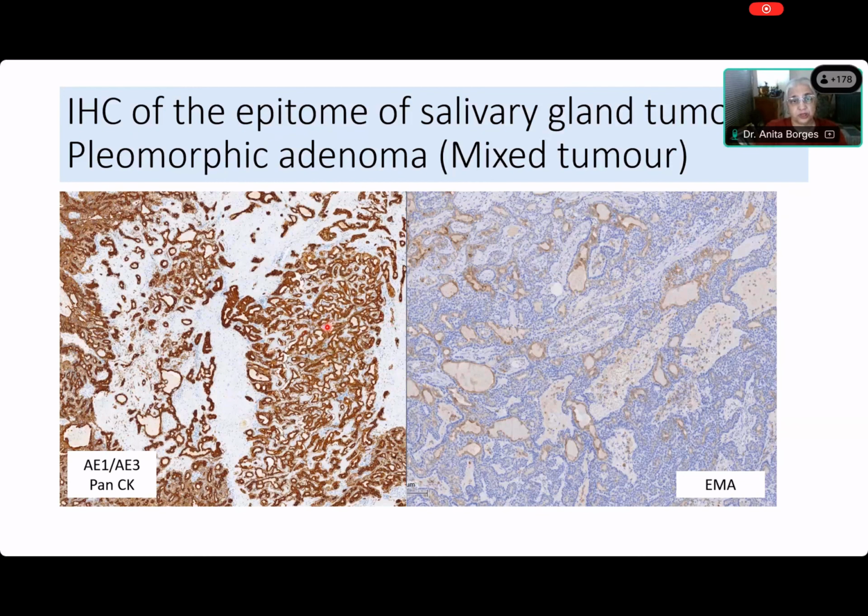You have got both, and you saw in the previous histology that you had luminal and abluminal cells, right? And you can see that nothing is remaining unstained in this. So both epithelial as well as myoepithelial cells. The luminal cells and the myoepithelial cells are all stained by pan-CK. Do you understand that, Akshara? Yes. All of you understand that.